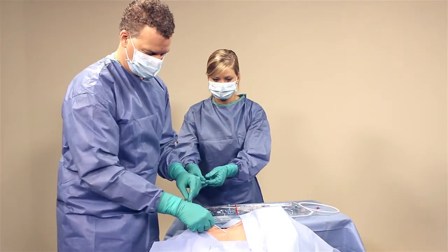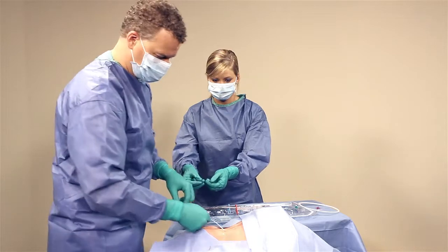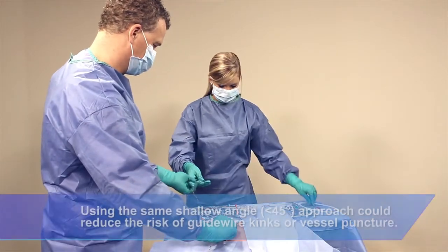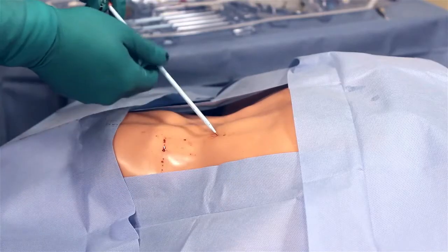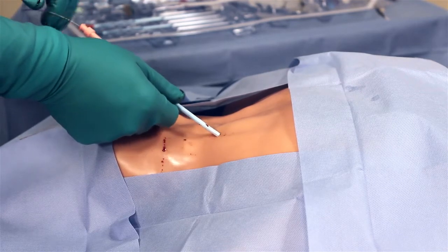After administering anticoagulation, proceed to dilate the insertion site. Slide the dilator onto the guide wire advancing it through the skin and into the target vessel using the same angle as the guide wire was placed. Repeat this process with larger dilators until the tissue is sufficiently dilated.